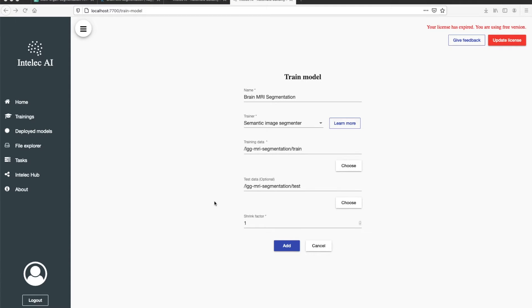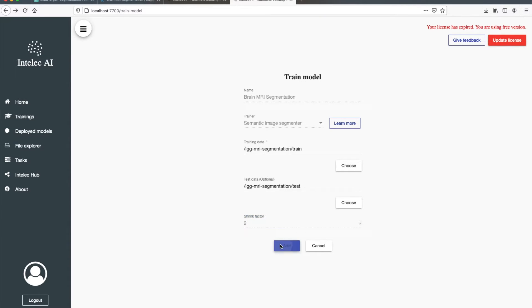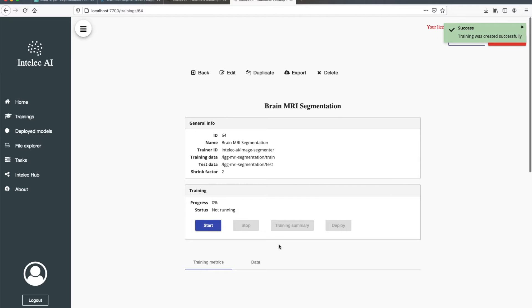I will also shrink the images two times. It will speed up the training. But one needs to be careful with this because shrinking the images too much might decrease the accuracy. So I add the training.